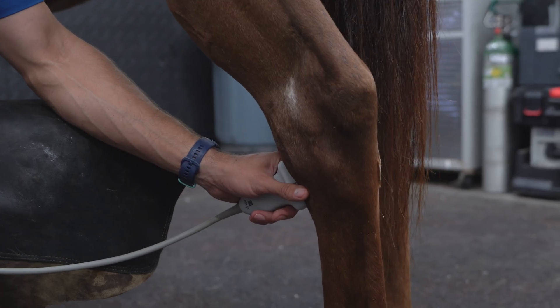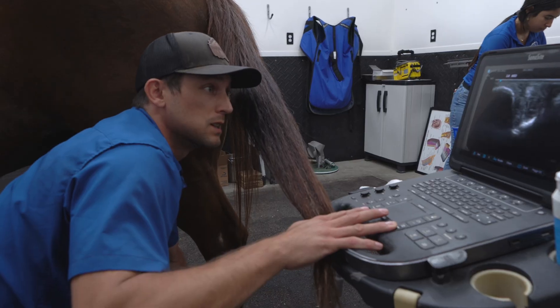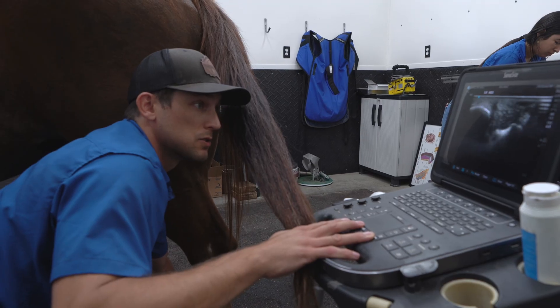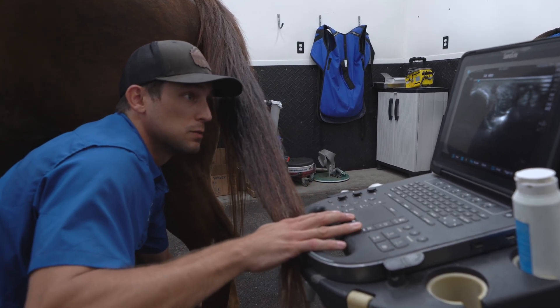Looking at this medial suspensory branch, we do have some fibrosis, scar tissue, some edema, inflammatory fluid, and bony surface changes on the insertion on that sesamoid bone on this medial suspensory branch.